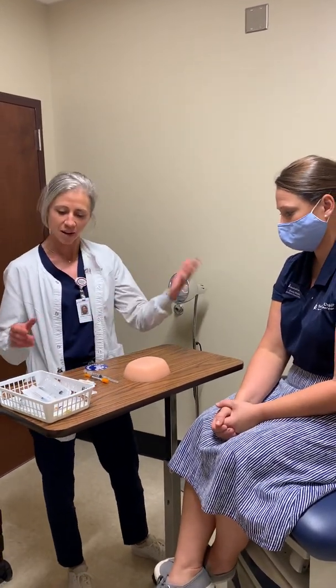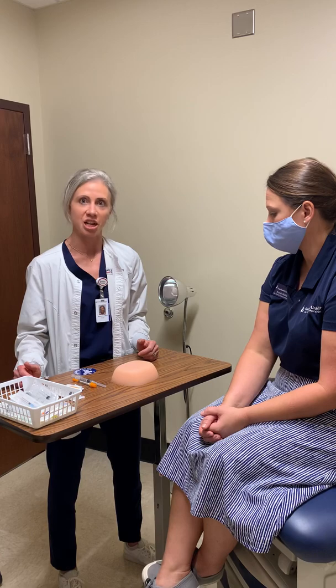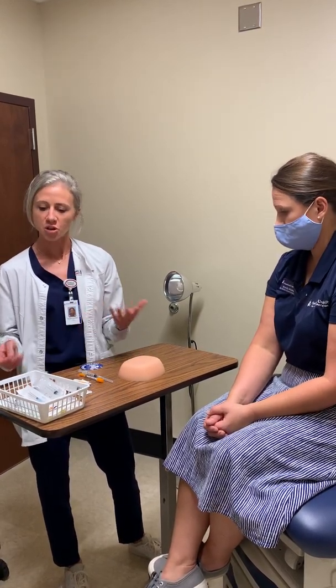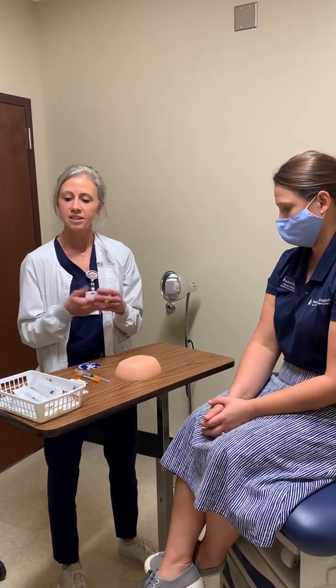All right, then I want to make sure that I've had the right medication. I've got my patient, I've got my right medication, so I wanted to make sure the doctor has ordered for Brandy Mobley to get a subcutaneous injection today. She's going to be getting a Lovenox injection, so I want to make sure that I have the right drug, so I'm going to look at mine. Now in the hospital, Lovenox is going to come in a pre-filled syringe, which we'll be pulling out of the Pyxis, but for the sake of this video, we're going to show you what that would look like with just the syringe. So I'm going to be giving her a subcutaneous injection. I make sure that I have my Lovenox, I've got my right medication.